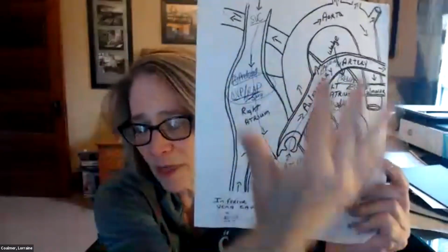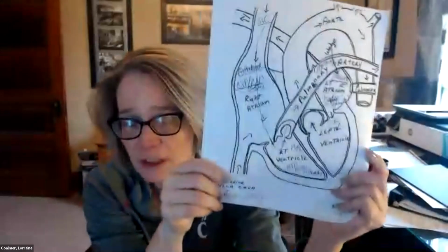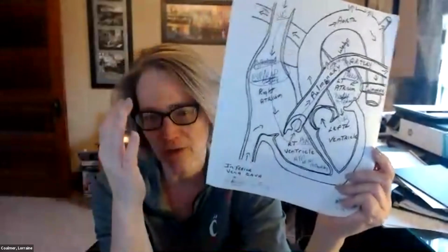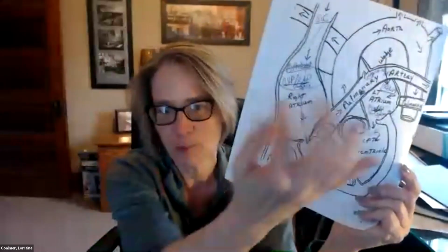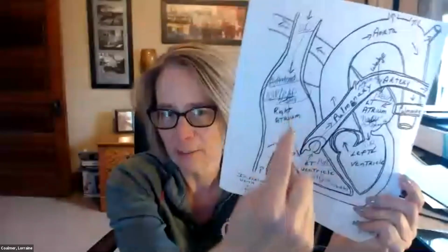I really work with this and understand the flow first. I start with this because I'm a simple person. So do I understand where the catheter is, where it's ending up, what can I measure? And I like to do visual and I like hands-on, so I'd probably color this, colors or whatever, to make me understand what direction the flow is, what numbers would be where.